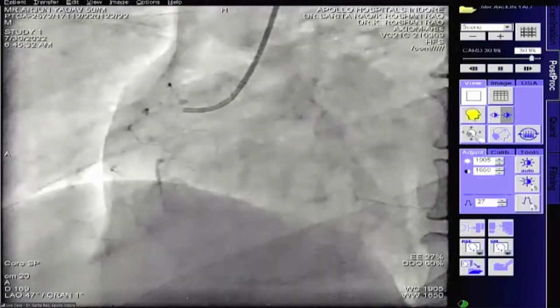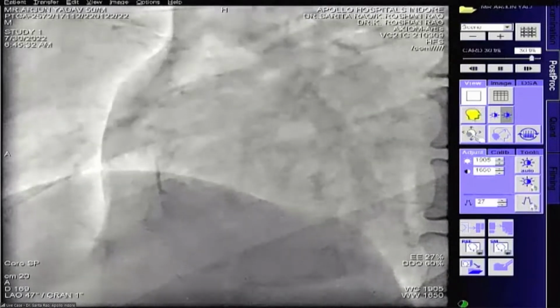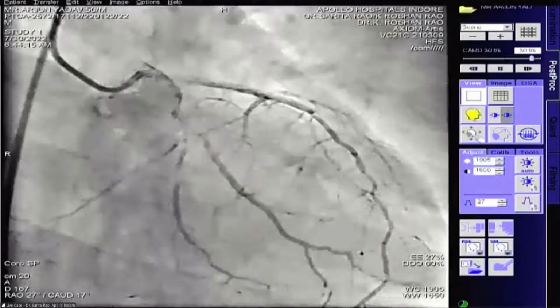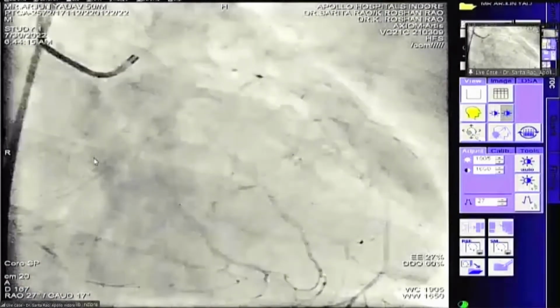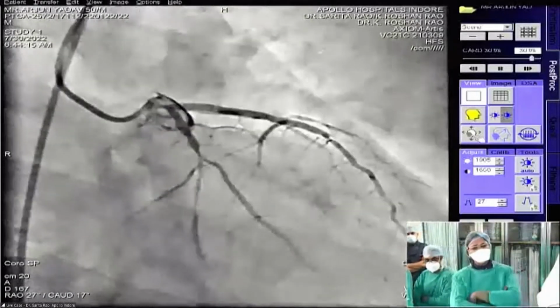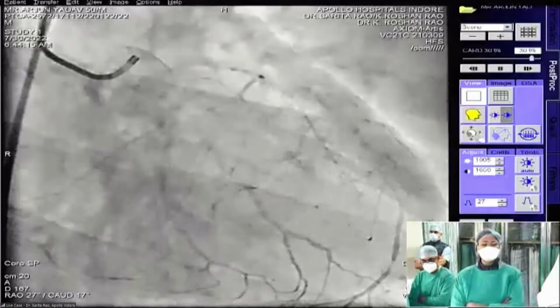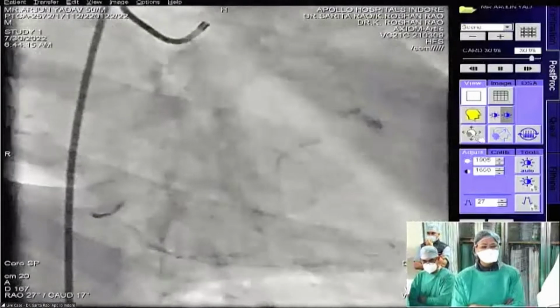Thank you. I think that's a great segue. Dr. Sandeep Bansal is here. What do you think? We generally would do the tougher lesion first. So one would approach the right coronary first. This is a surgical reject, but by and large, if we are approaching a patient who's not been decided or has been taken up for PCI itself, we would first approach the right coronary artery, and if you can't do that, then send the patient for CABG. But here, since it has already been refused, I think even approaching the left system may be a good option.